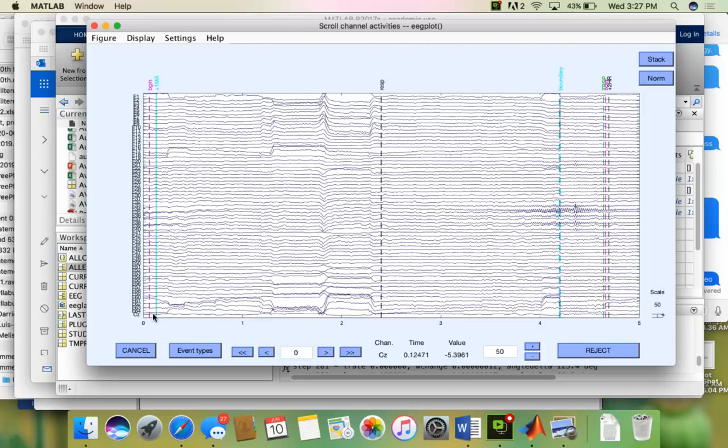Now, why would we put that delay in there? We put it in case you want to look at the data before the stimulus was shown. So the system syncs everything, then there's a slight delay, and then the person is shown the picture of the Mad Avatar on the screen. We record their EEG data at this point, and for this person it was about 2.4 seconds before they came in and answered what they saw.